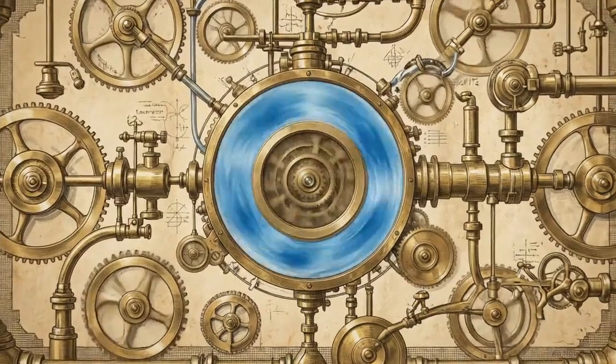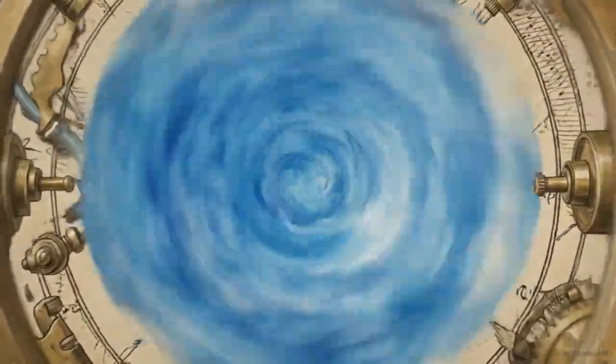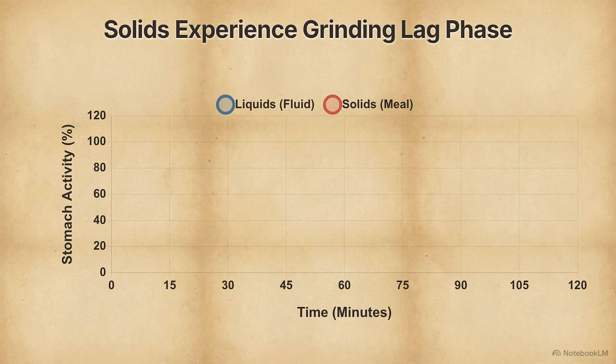GI nuclear imaging is an active diagnostic process. You mathematically and chemically force the body to reveal its functional failures. The gold standard for evaluating delayed gastric emptying, known as gastroparesis, typically seen in diabetic patients, is the technetium-99m labeled sulfur colloid scan. Look at this time activity graph.